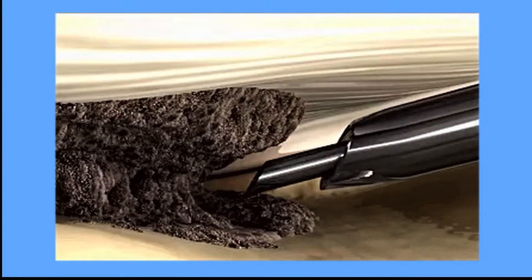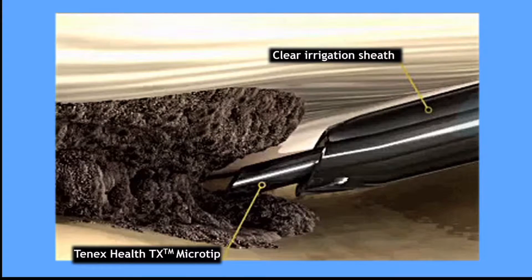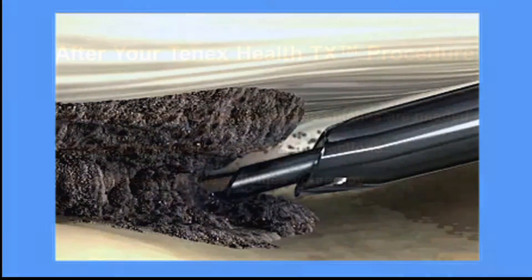The TX micro tip is inserted through a tiny incision to break down and remove the pain-causing damaged tendon tissue. Surrounding healthy tissue is not disturbed, and the process stimulates a natural healing response.